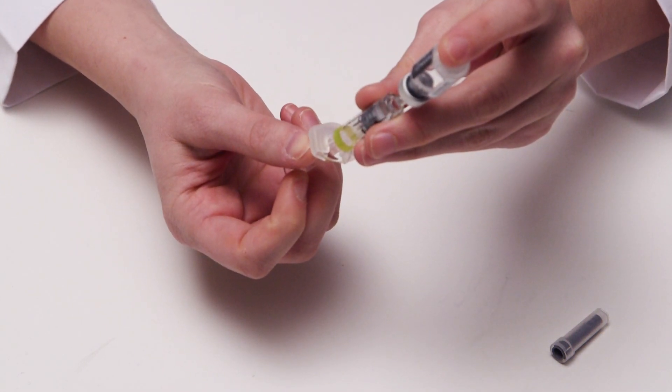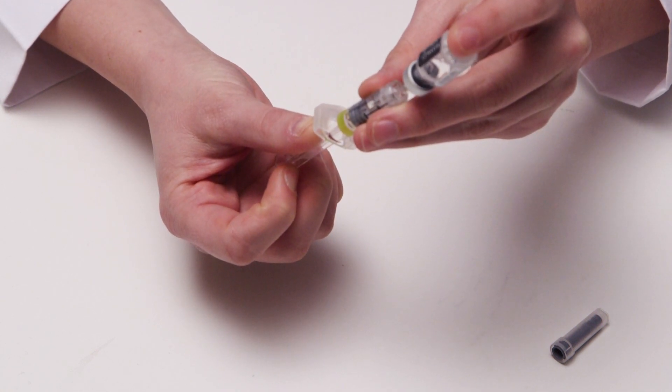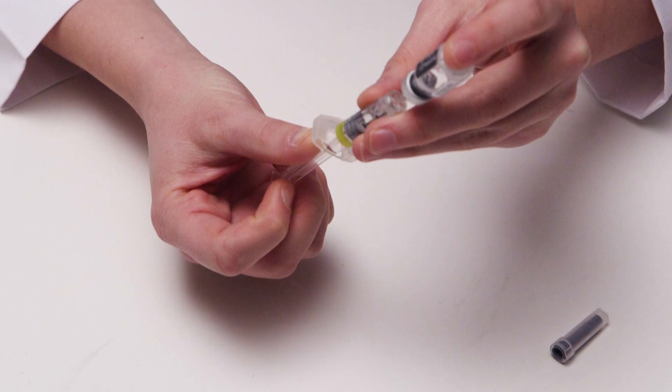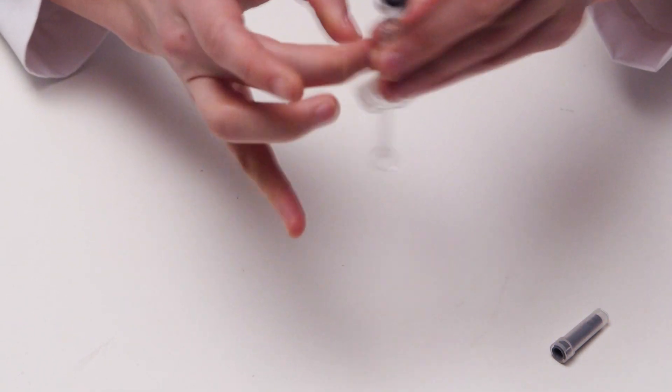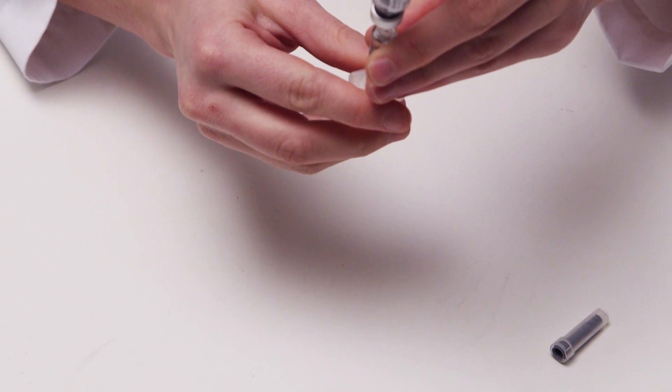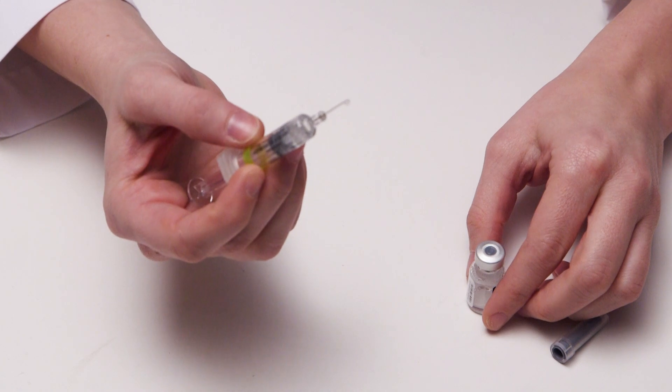Draw up the mixture into the syringe. Once the syringe is full, remove the vial and make sure you remove any bubbles from the syringe. Now, the injection is ready.